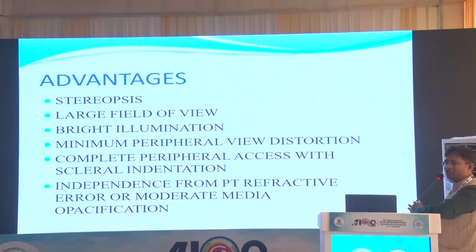What are the advantages of indirect ophthalmoscopy? It gives stereopsis, a large field of view, bright illumination, minimal peripheral view distortion, complete peripheral access with scleral indentation, and independence from patient refractive error or moderate media opacification.